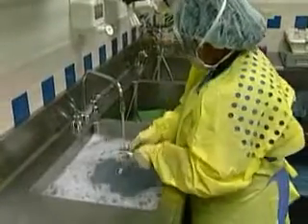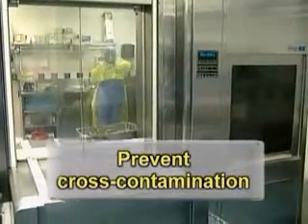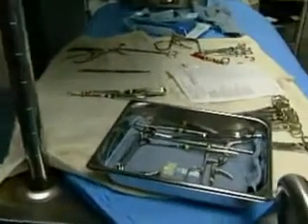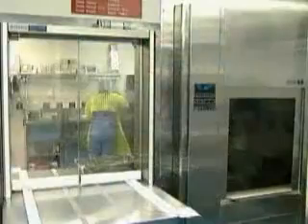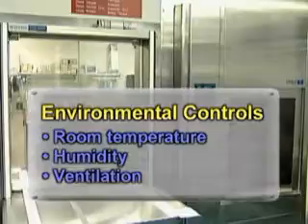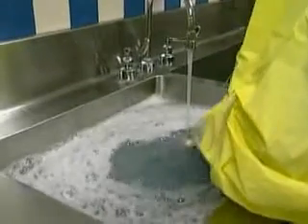The decontamination area should be separate from the clean preparation area to prevent cross-contamination. If no division exists between the decontamination and clean areas, tasks should not be performed in each area at the same time. Environmental factors to be controlled in the decontamination area during the process include room temperature, humidity, and ventilation. Instruments cleaned manually are immersed and friction applied with a brush.